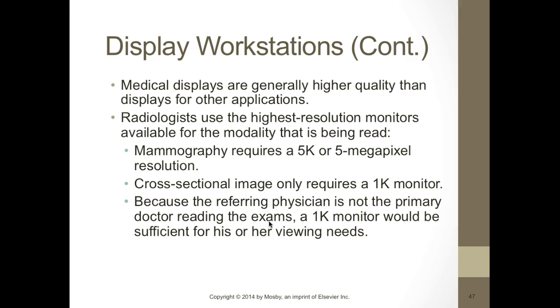Medical displays are generally higher in quality than displays of other applications. So radiologists use the highest resolution monitors available. Mammo requires a 5K or 5 megapixel resolution. So cross-sectional imaging only requires a 1K monitor, and that's usually what you're looking at.